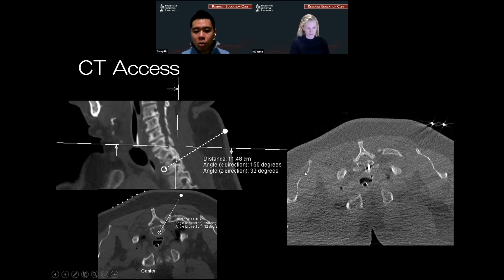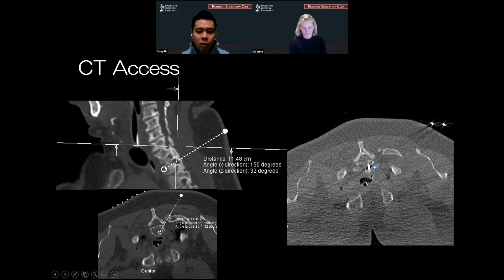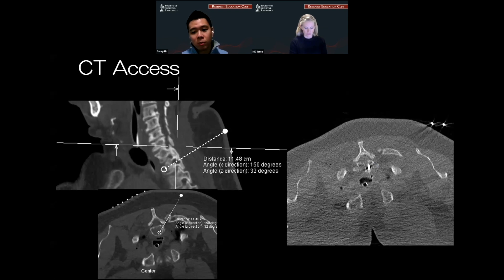Most of these access needles are about 10 to 12 centimeters. As you're going at such a harsh angle, you're going to have to have a really good grasp and spatial understanding of where that needle is, because you're only going to be seeing a little bit at a time. You can see here I've already reached my target — the needle is in the vertebral body.